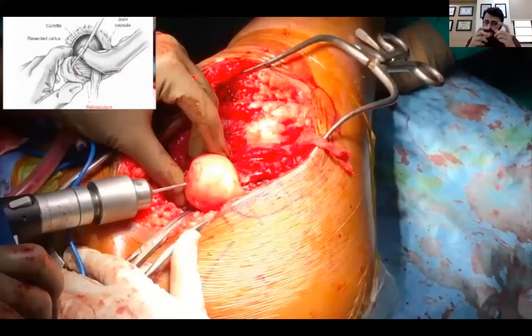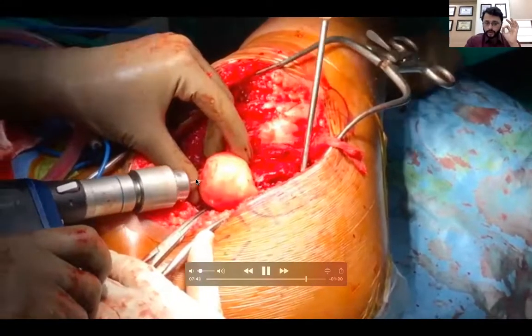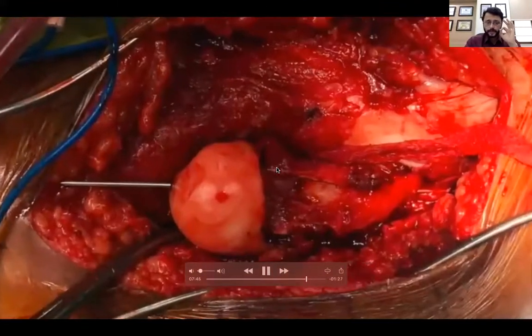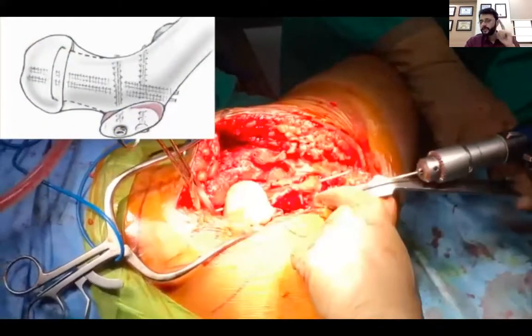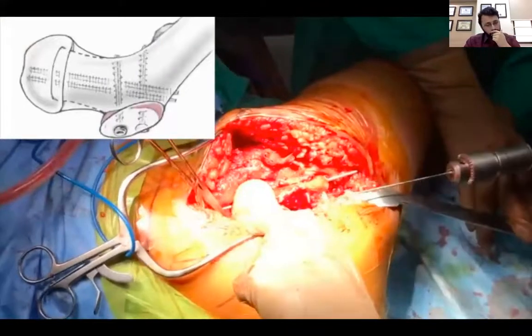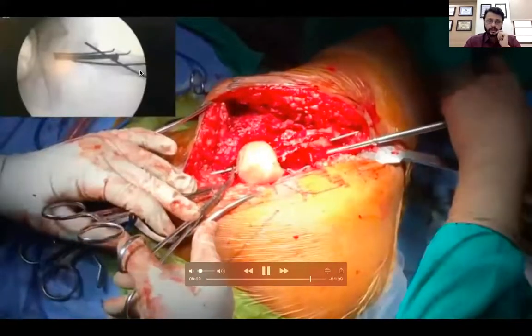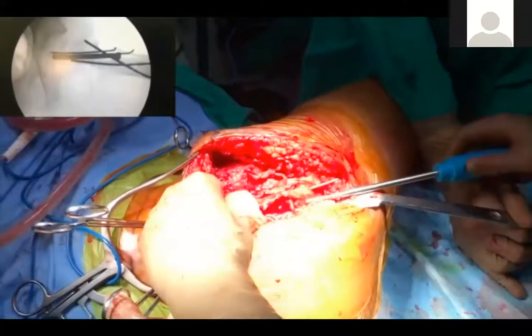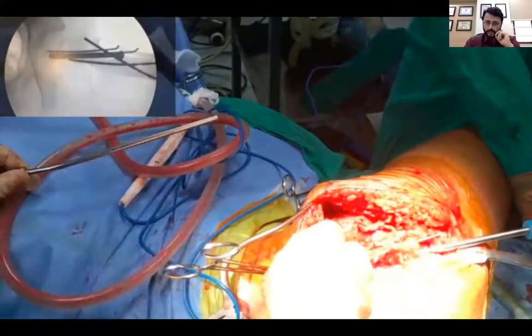In fact, once I reduce it, I usually palpate it posteriorly so as to know that there is no tension on the femoral head. Then I fix it retrograde, that is from the femoral head towards the shaft, keeping in mind that this bleeding continues. My usual fixation is two wires and one screw. There are some people who put two screws and one wire. I feel that one screw and two wires are enough. This is usually a 32 mm threaded screw. Prasad has tried to convince me to put a 16 mm screw. So in the last few cases, we have used a 16 mm screw.